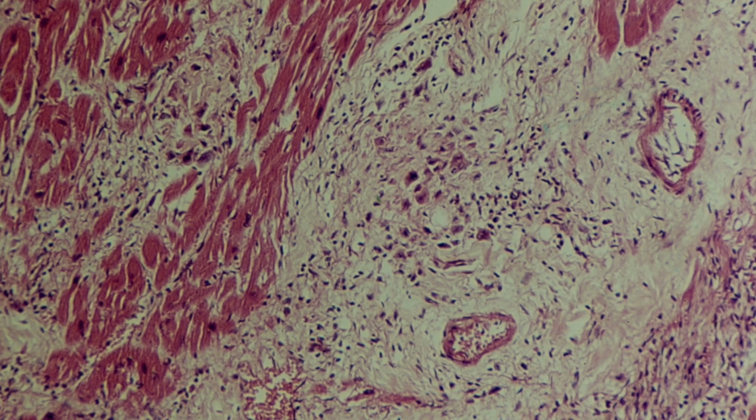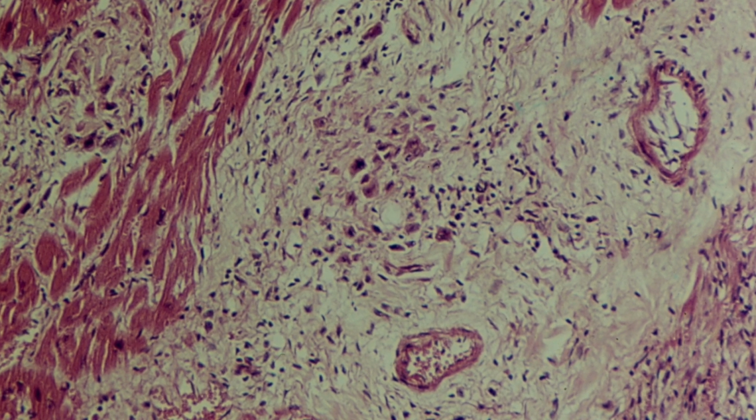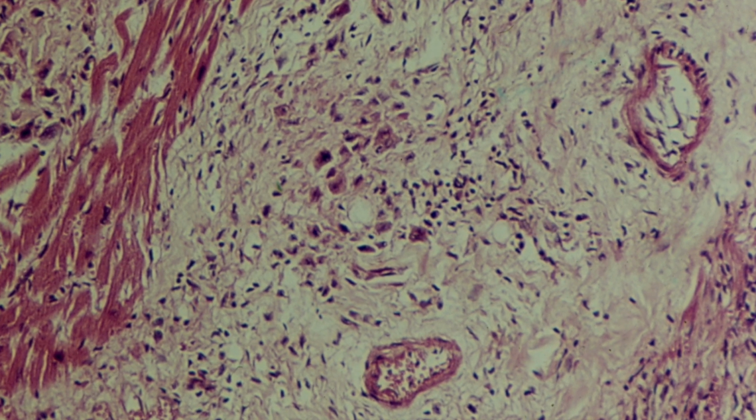Here is a low power view of an Aschoff body. You can see it's perivascular and it is at the center of the picture.